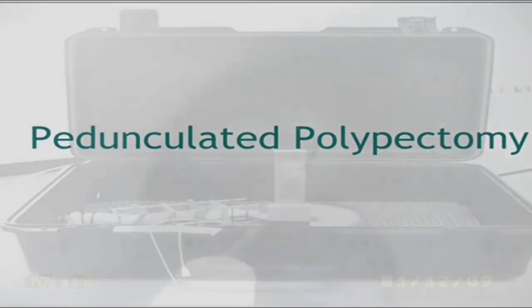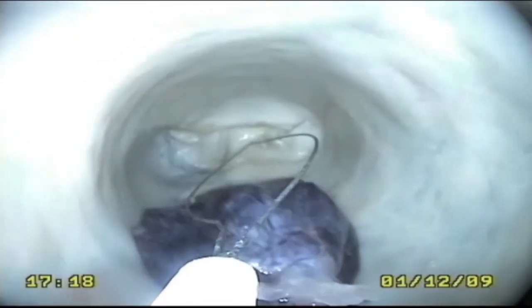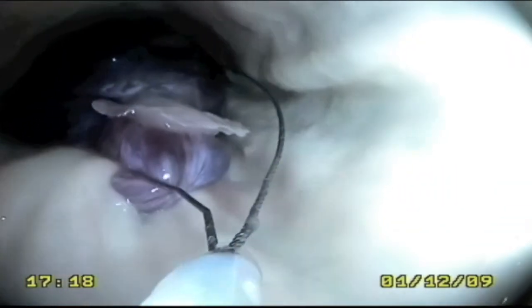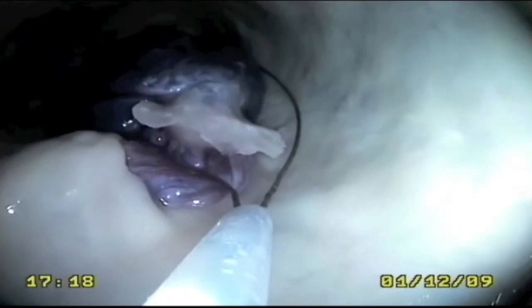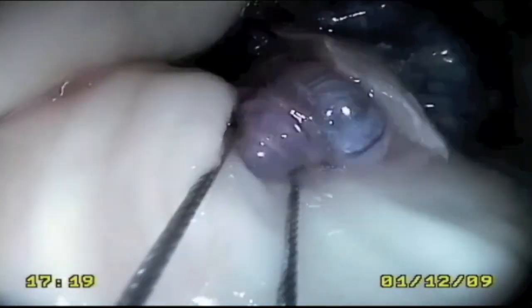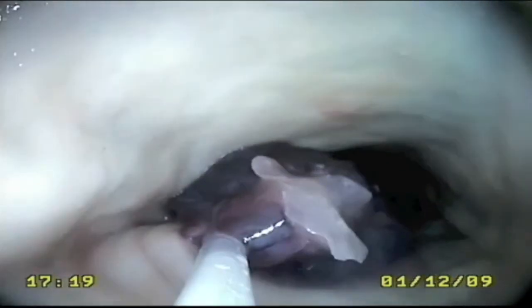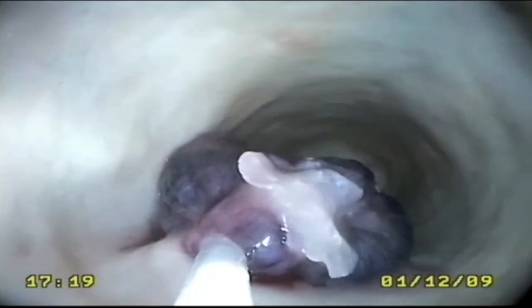Pedunculated polypectomy. Once the simulated pedunculated polyp is identified, it can be positioned in a standard manner and a disposable snare inserted and opened. The snare can then be placed around the polyp base and closed, thus securing it in position. Once the user is happy with their position, diathermy can be used in order to separate the polyp from the bowel wall.